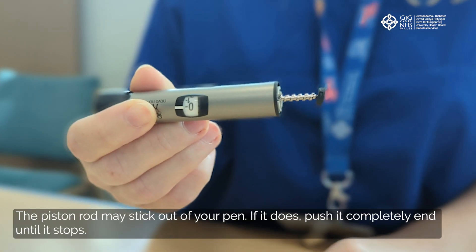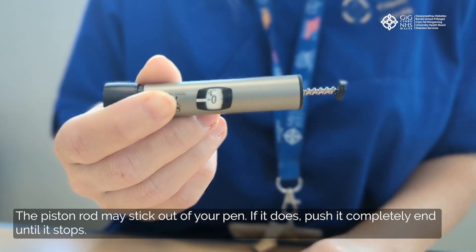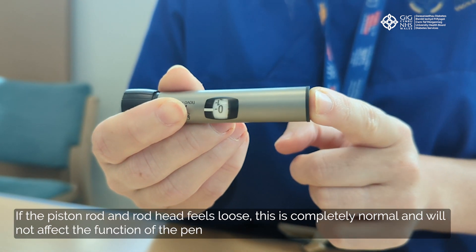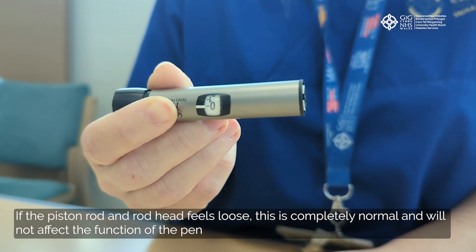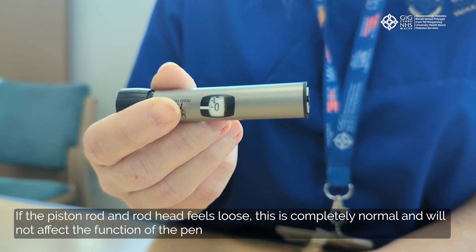The piston rod may stick out of your pen. If it does, push it completely until it stops. If the piston rod and rod head feels loose, this is completely normal and it will not affect the function of the pen.